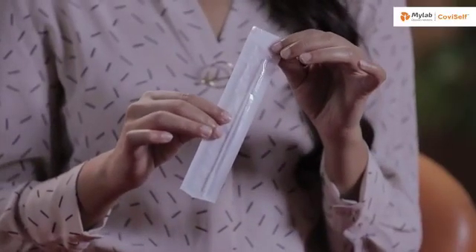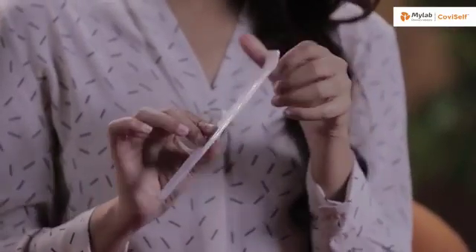This is a sterile nasal swab. As you can see, it has two sides — one is the plastic side and the other one is the paper side. One test card. This is a biohazard bag.